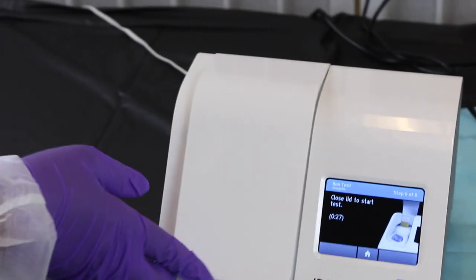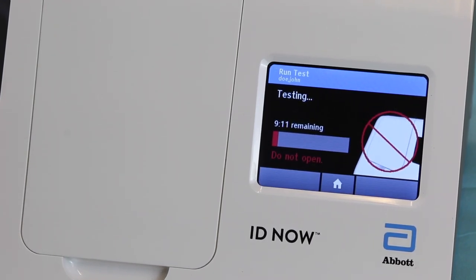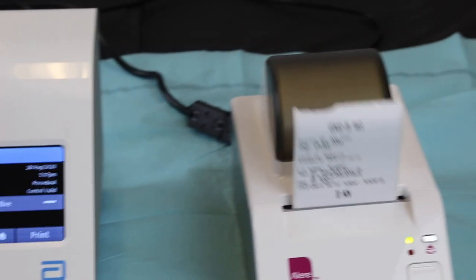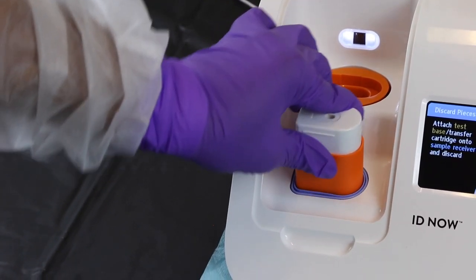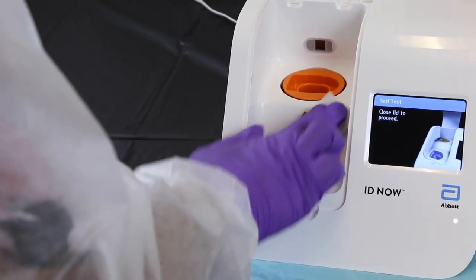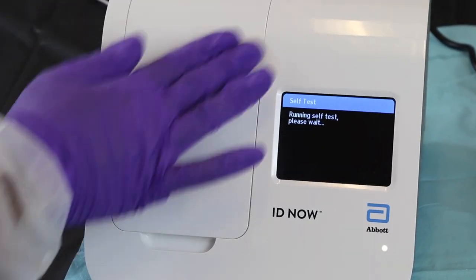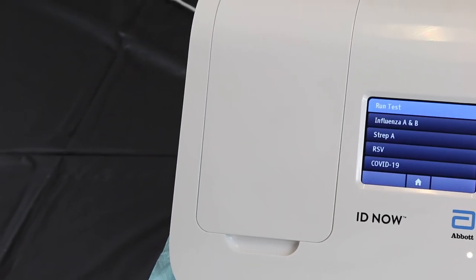Close the lid within 30 seconds or it will time out. The machine will run the test with a 10-minute countdown. If results appear in less than 5 minutes, it is likely either positive or invalid. Once the test is complete, print out the result. Hit 'New Test' and the machine will instruct you to discard the base, cartridge, and receiver in the trash, as was done in the QC test. Wipe down the machine with a 70% isopropyl alcohol swab, making sure to avoid the wells. Now you're ready for the next test.